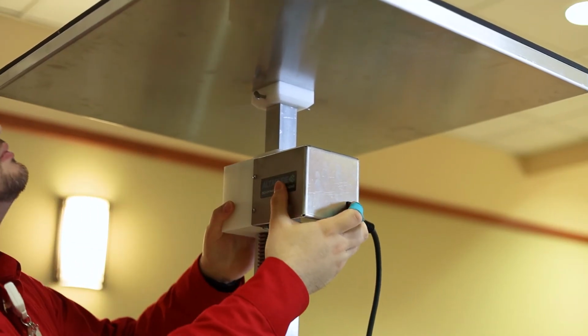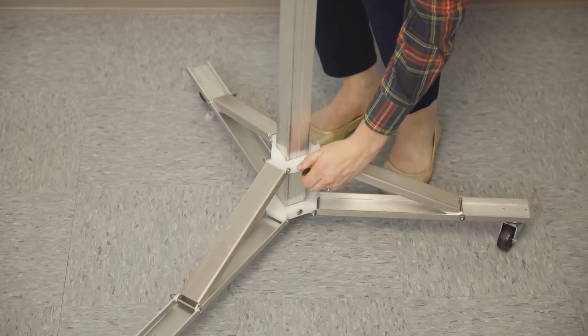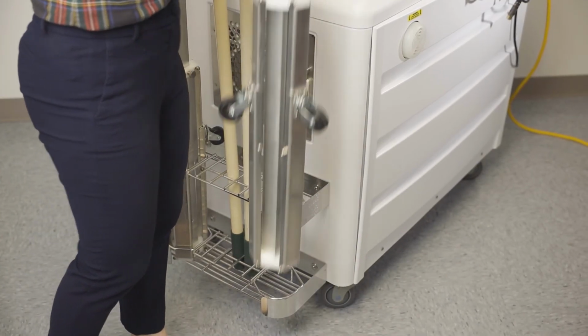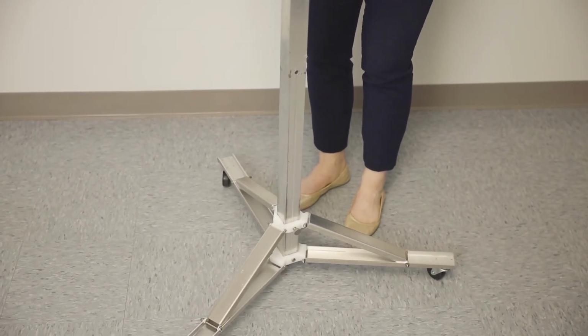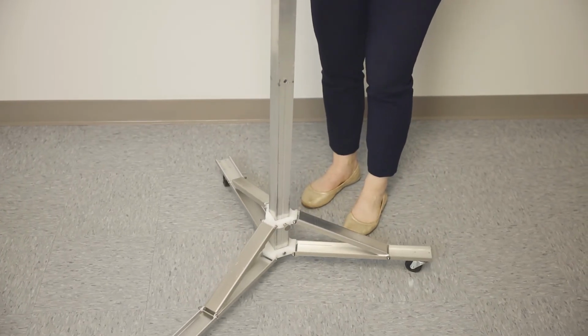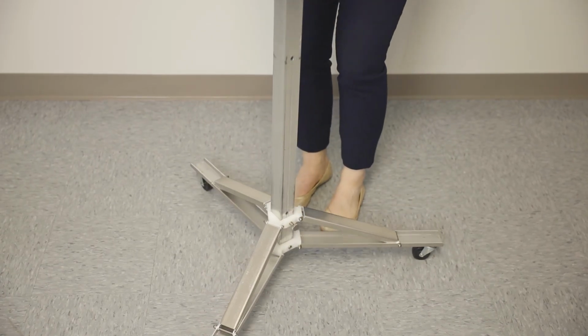The automatic tripods are easy to use and store. They are collapsible and store easily into the rack at the front of the AP4. To set up, lift out of the rack and pull the pin located here. The arms of the tripod will come down, and then you lift the pole slightly until you hear the pin lock into place at the bottom hole. Be sure not to turn the pin when you pull it out, as this will prevent it from locking.